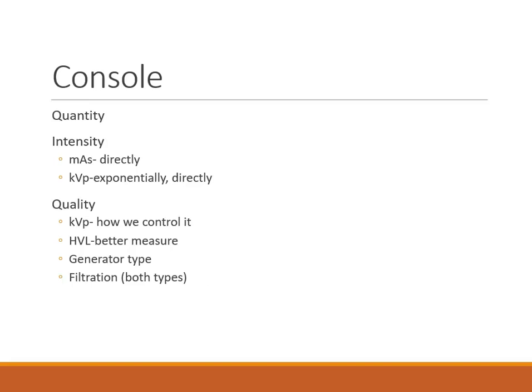Now, if you had two X-ray beams with exactly the same technique and exactly the same output, so you've got two different X-ray units in two different rooms, and both of them generate a beam with 70 kVp at 25 mAs, and they both have 100 mR of exposure at the collimator, and in one of the rooms you put a single millimeter of aluminum and it cuts it in half.